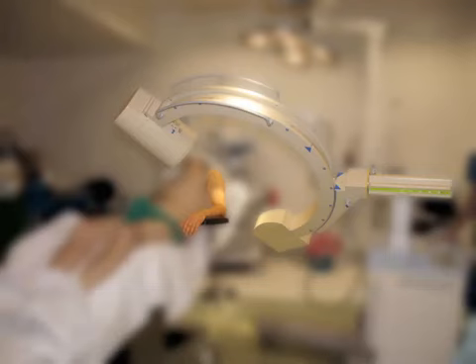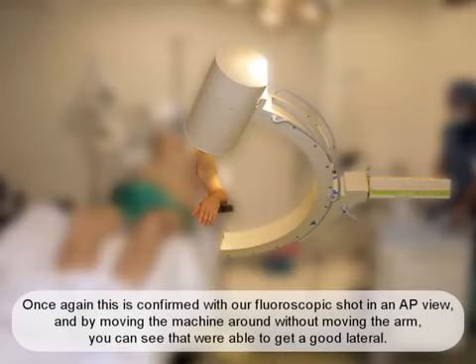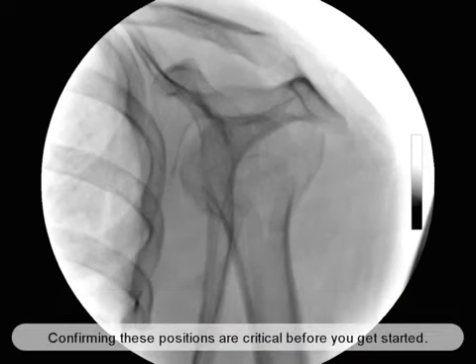operative field. Once again, this is confirmed with our fluoroscopic shot in an AP view, and by moving the machine around without moving the arm, you can see that we're able to get a good lateral. Confirming these positions are critical before you get started.